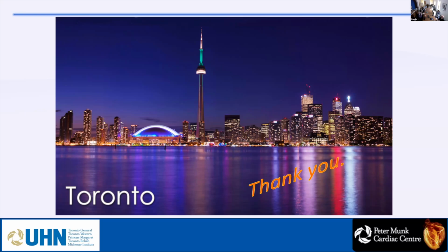If I do it myself, they listen to me. If I don't, it's because this measurement is very, very difficult. But usually they listen, and I ask them most of the time to measure by the instrument themselves to see how I'm doing, and I watch them also. So all of this repair that you see, I'm there. I learn from them, and they learn from me. That's right. No, they listen.